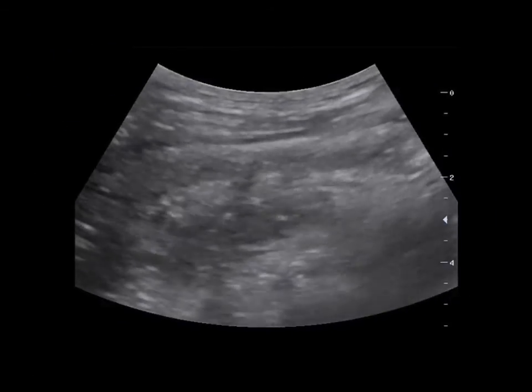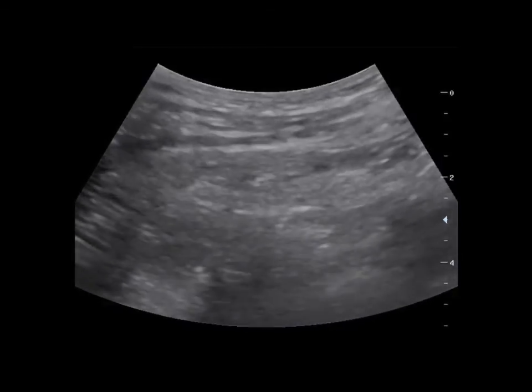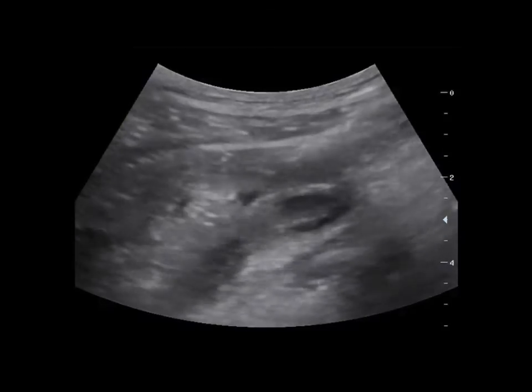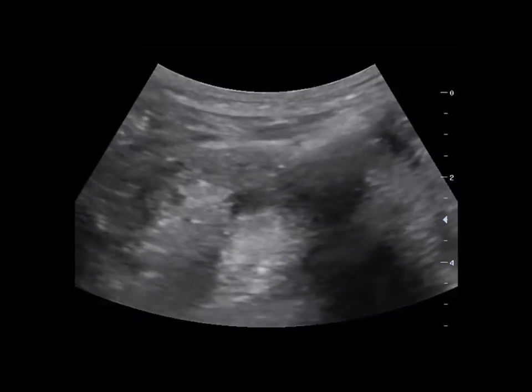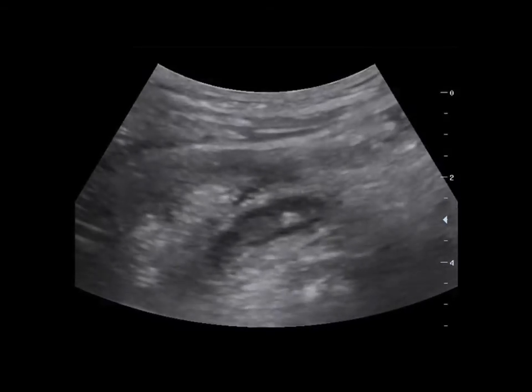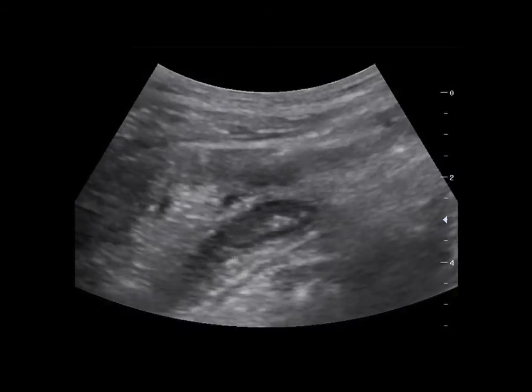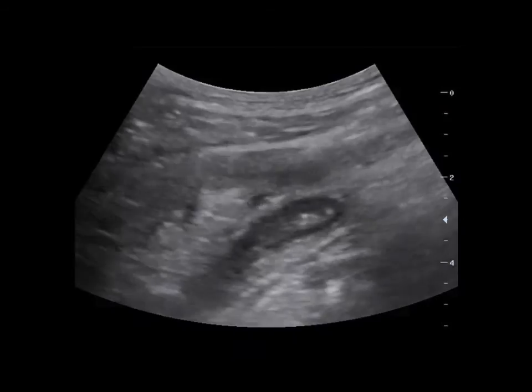Here's another nice example, again a longitudinal view with the probe marker pointed towards the patient's head. This is using a curvilinear probe. And again, here's your non-compressible structure that is not peristalsing. This one was about 10 millimeters in diameter and also has an area within the appendix that is probably a fecalith sitting at the tip.